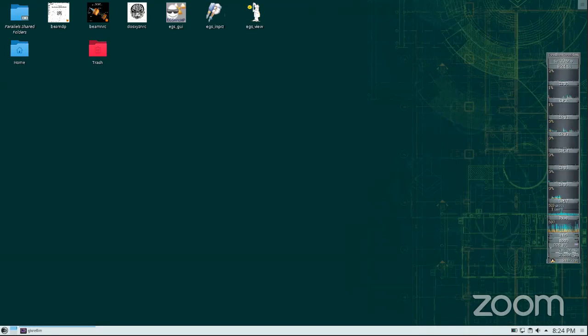This is how we make sure, when we do the beam simulation, that the companies give us whatever geometries and so on, but there are some issues they don't give us, and we have to figure out, guess, tweak, manipulate, and we rely a lot on the measurements. We know we measure the PDDs accurately.